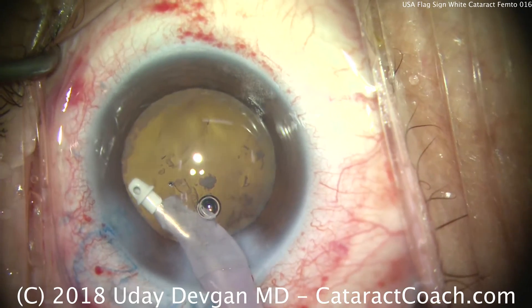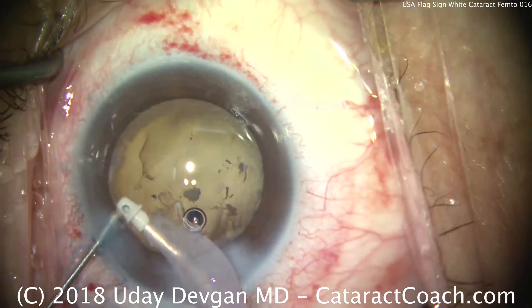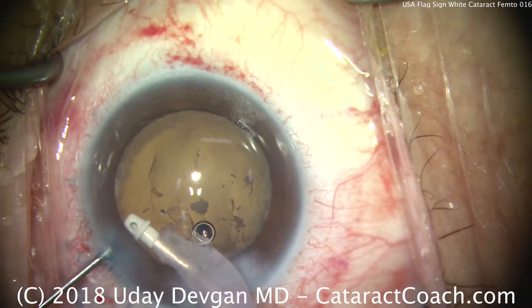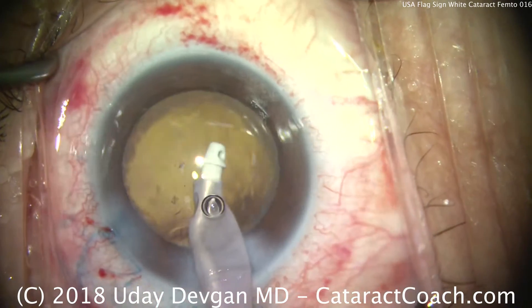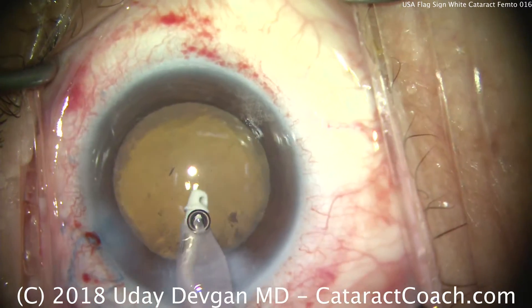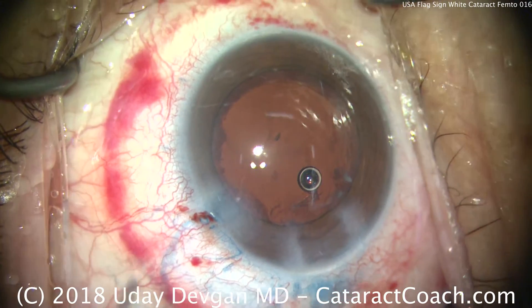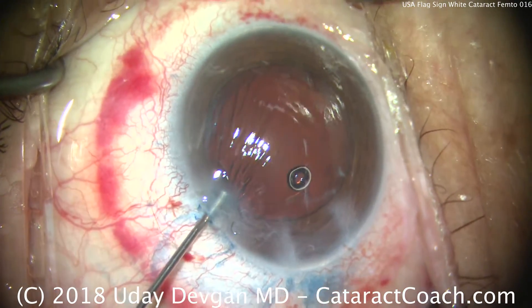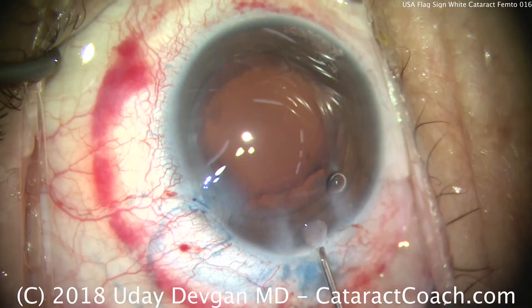I will admit that the femtosecond laser is a very expensive piece of machinery — half a million dollars or more, with a very high cost per use. But in certain cases like this, it certainly does make things a little easier. If you don't have access to this very expensive piece of equipment, watch the other videos. You can still do an absolutely beautiful job without using the expensive femtosecond laser.